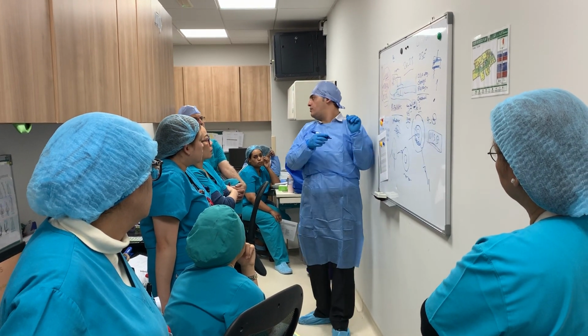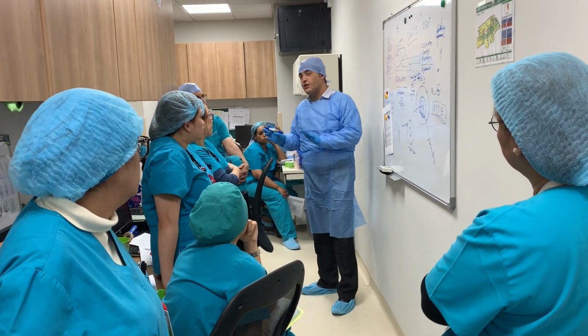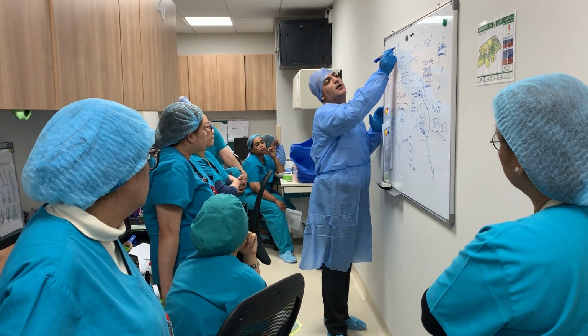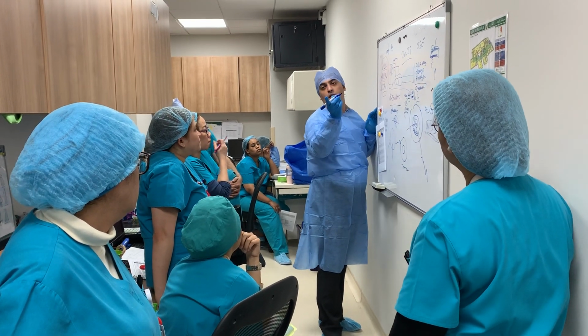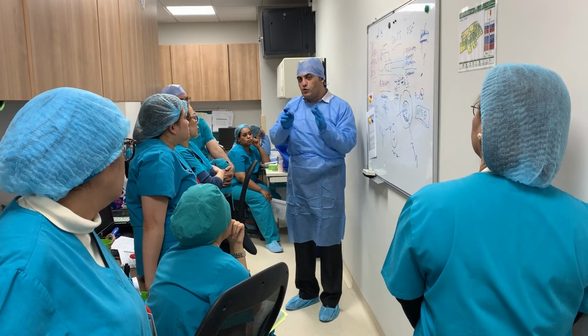You don't need centrifugation to wash it. All you need is a magnet. You have the tube, the magnet is here, and you get the particles close to the wall with the magnet. Every single day or every single use? Every single dose, not the whole stock.